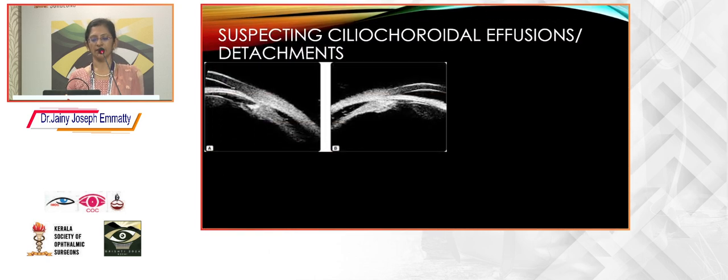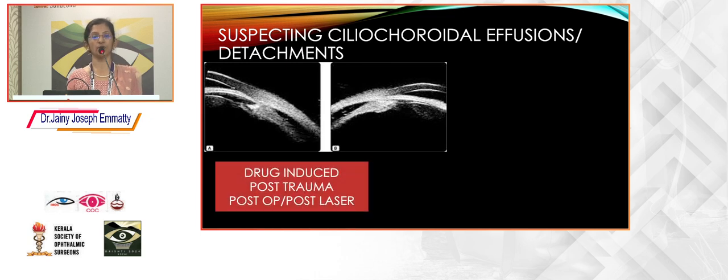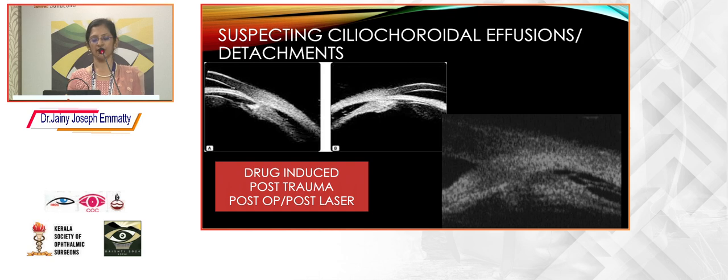In conditions in which a young patient presents with acute onset transient myopia with bilateral angle closure, which can be drug-induced, the supraciliary effusion can be well visualized with the UBM. Also in post-traumatic cases, post-trabeculectomy, the ciliochoroidal detachments, and post-laser, all are better visualized with the UBM.